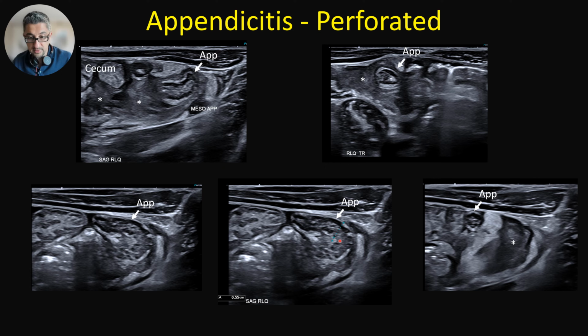And this is the distal appendix, which appears normal, but proximally that's the fluid collection. And there is discontinuity of the appendix from cecum, as you can see here. So cecum, and we lose the appendix, then we start seeing the distal appendix. But this is the site of the disruption, and it was confirmed at surgery. Completely disrupted appendix.